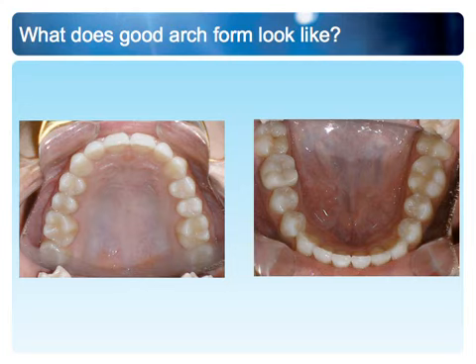Go from the buccal cusps of your second molar to your first molar through your premolars, and then start hitting the incisal edges of all those anterior teeth and come right back around to the other side. Now, this right here would be an excellent example of what good arch form looks like. So if we can trace these buccal cusps through the incisal edges and work our way all the way round, we've got great arch form.